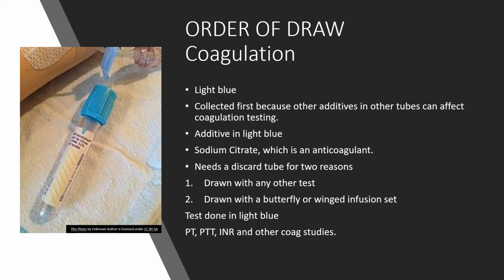So there is a caveat to this, or an exception to this, okay, where we do draw out of order, and it involves the light blue top, okay? So if we're drawing the light blue top, there's two reasons we would need what we refer to as a discard tube, okay?